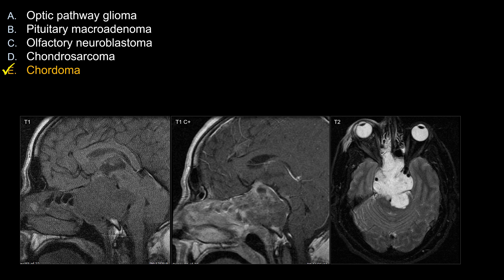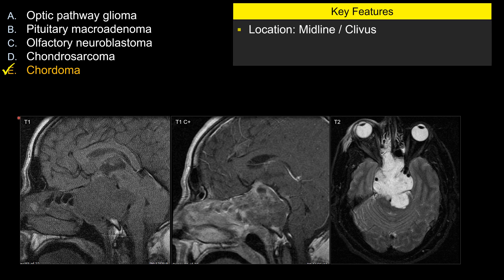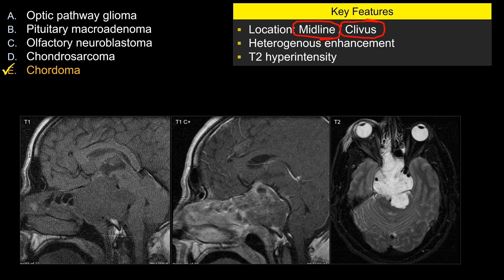Let's look at some of the image features that make E the best answer. You can see there's a mass lesion centered within the clivus with heterogeneous enhancement. This lesion is centered right in the midline, expanding outward and involving the clivus. The key thing is that it's very bright on T2-weighted sequence. For a board exam buzzword: think about a lesion involving the midline clivus with T2 hyperintensity — that's pretty good for chordoma.